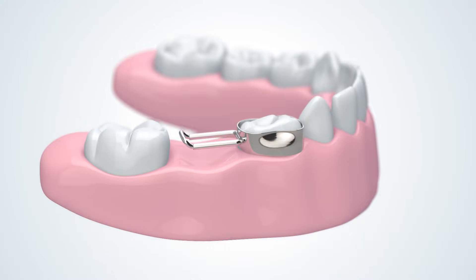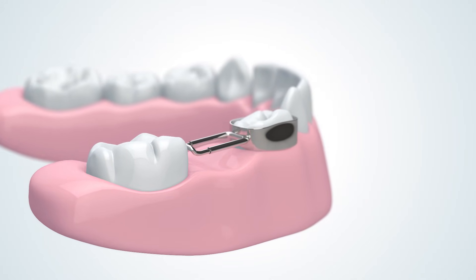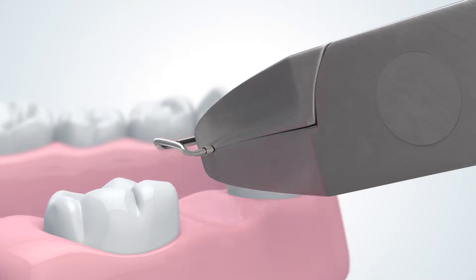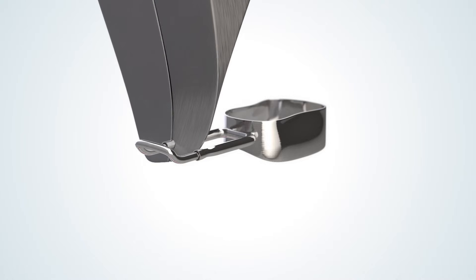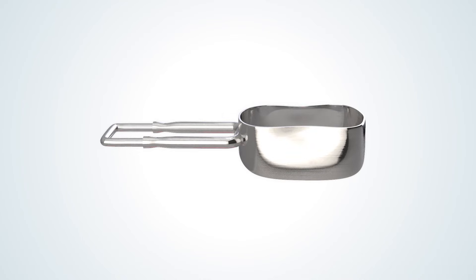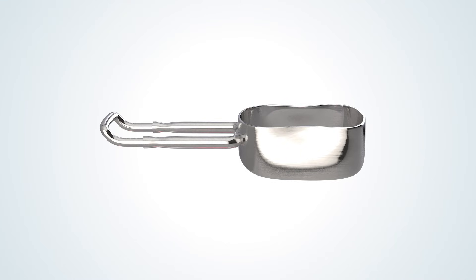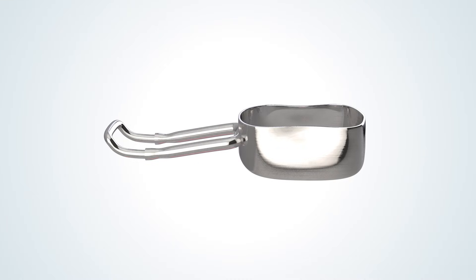Reseat the appliance and slide the wire across the gap to save the space. It is important to ensure the wire will not drift down into the gingiva. Using the DeNovo tube crimper, lightly crimp the tube in the mouth to maintain the adjustment, then remove. With the appliance out of the mouth, apply a solid, circular crimp to both tubes to firmly lock the wires into place. Test the strength of the crimp using normal finger pressure to pull the wire. You can then adjust the wire so that it does not drift down into the gingiva, using the drop wire or by adapting a plain wire with an upward bend using the DeNovo 2 jaw plier. The 3 jaw or DeNovo 2 jaw can also be used to add curvature to the loop, which matches the natural contour of the gingiva.